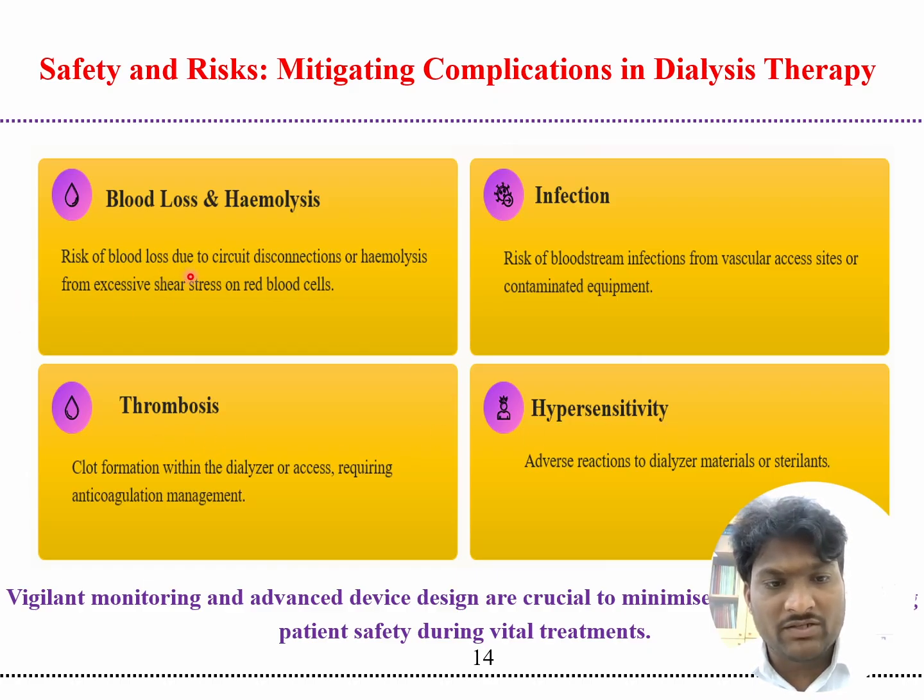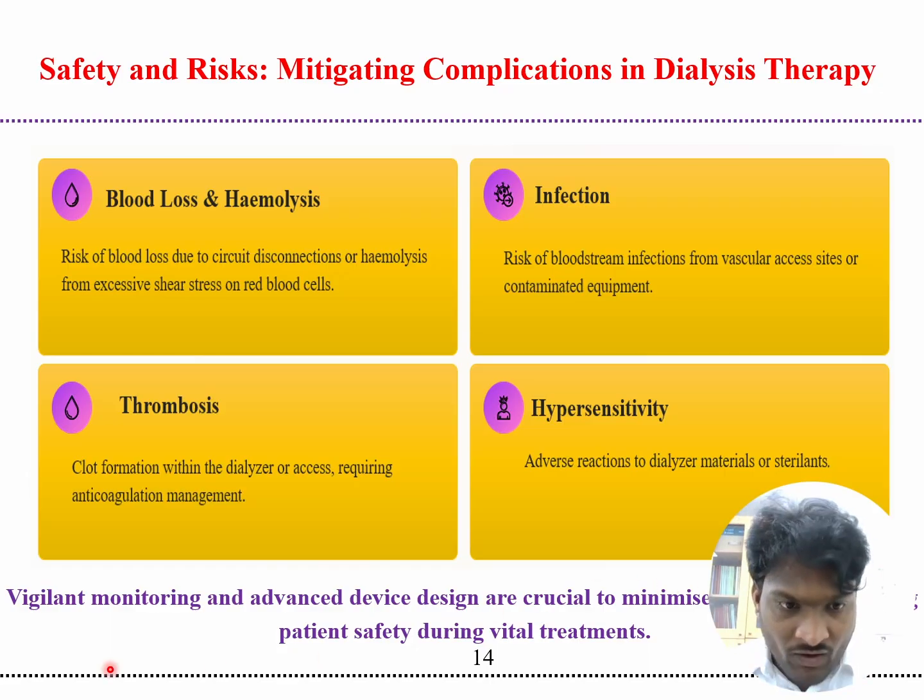There is the risk of blood loss due to circuit disconnections, or hemolysis from excessive shear stress on the red blood cells, and the risk of bloodstream infections from the vascular access sites or contaminated equipment, and clot formation within the dialyzer, requiring anticoagulation management, and adverse reactions to dialyzer materials or sterilant.